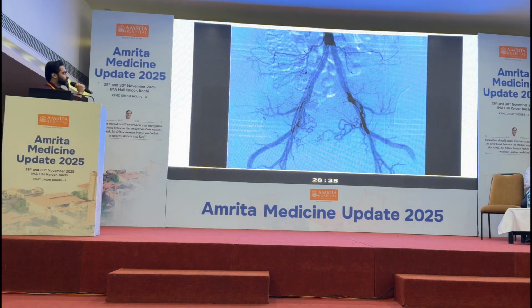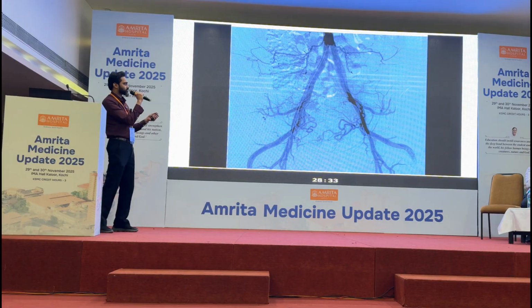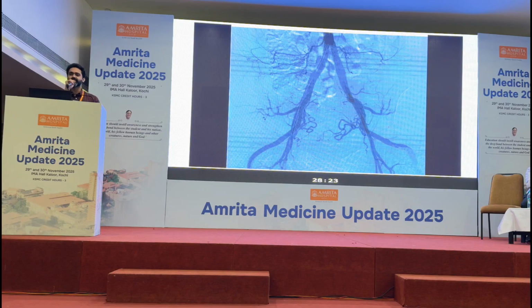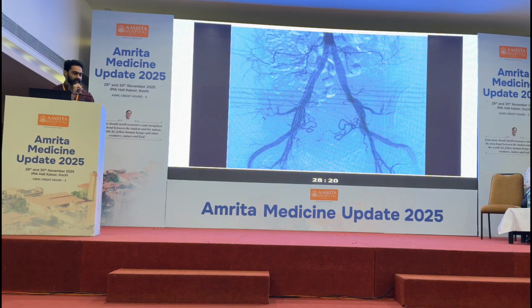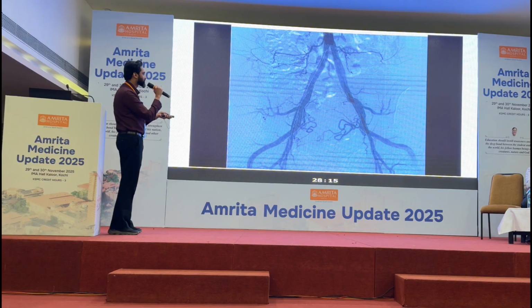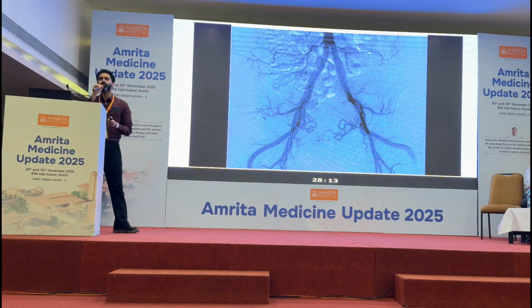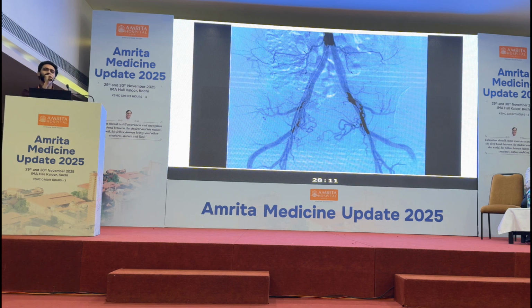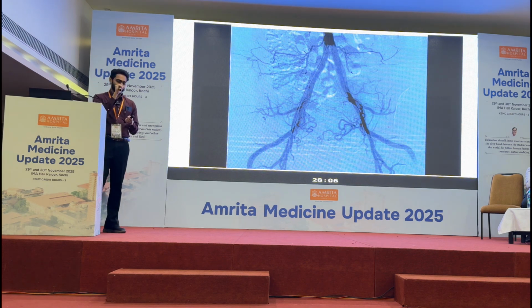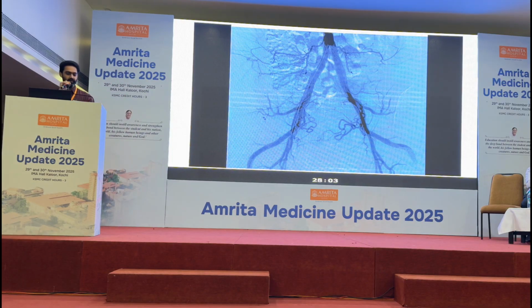This is an angiogram. Actually, this is a spotter for our residents, which shows an abnormal sciatic artery. Normally, the femoral artery comes from the external iliac artery. Here, you can see that it is going away from the femoral head. So, this is a persistent sciatic artery. These patients are prone to develop ischemia if they sit for a long time, because the sciatic artery goes underneath the ischial tuberosity and they can eventually develop thrombosis or aneurysms at that site.